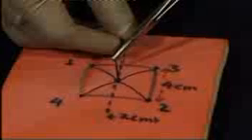The ends of the suture are held with a needle holder or an artery forceps, cut 1 centimeter from the knot and pushed inside. This invaginates the knot and prevents any sinus formation.